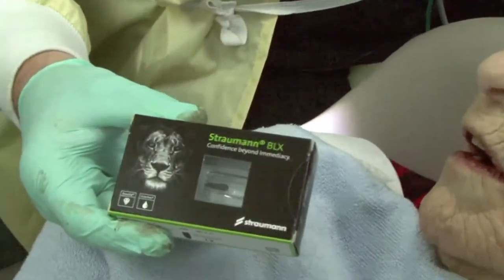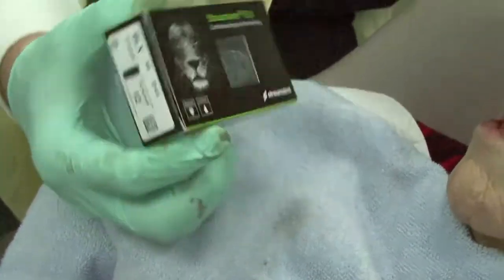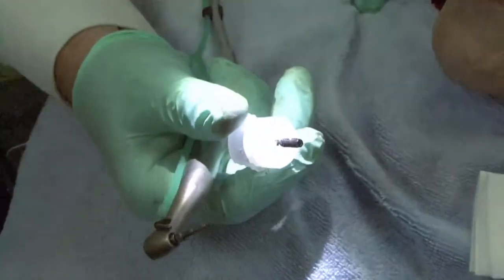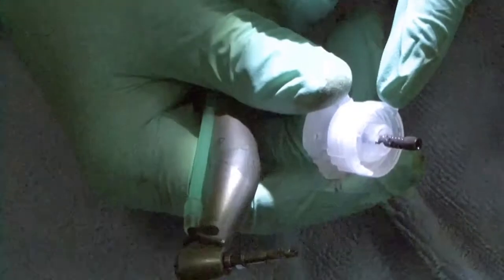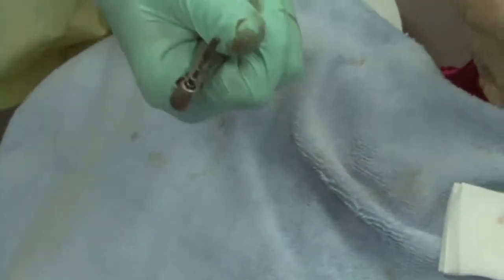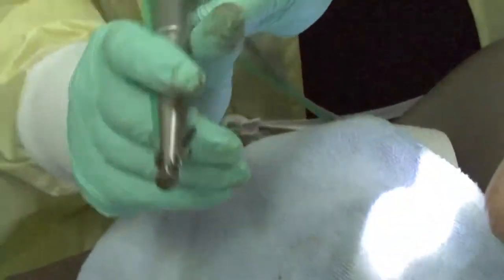So this is our BLX implant, and you'll take a look at how it comes out. There is the information that you need to see: the taper, the width, the length. So this is what the implant looks like. Here, there's a very tiny area of metal, titanium, and what we're going to do is we're just going to place this in, and then all we're going to do is bend it. Now it's ready to go ahead and be used in the mouth. We're going to start to drill this into place. It won't go very far before we need to use a ratchet.